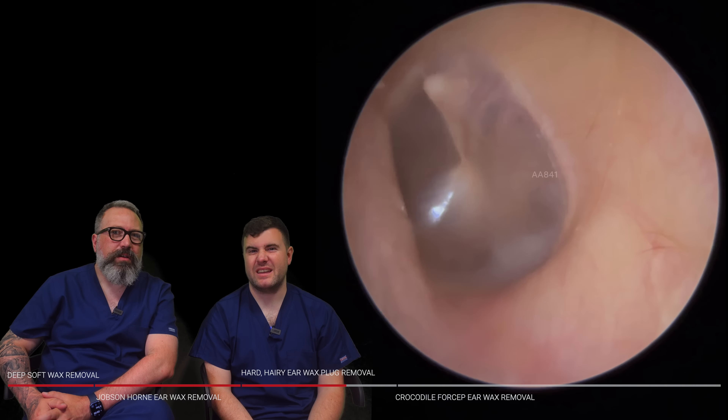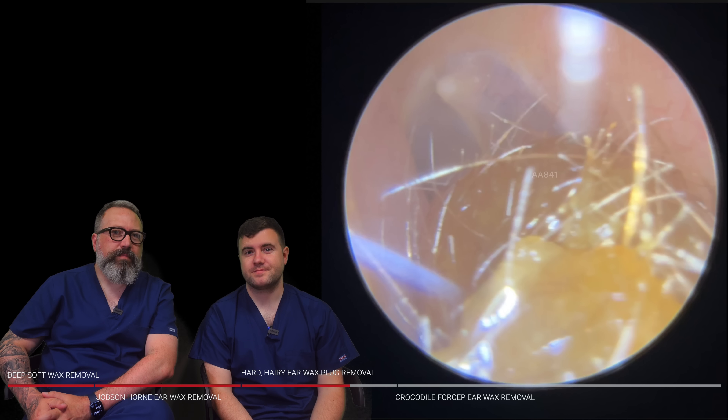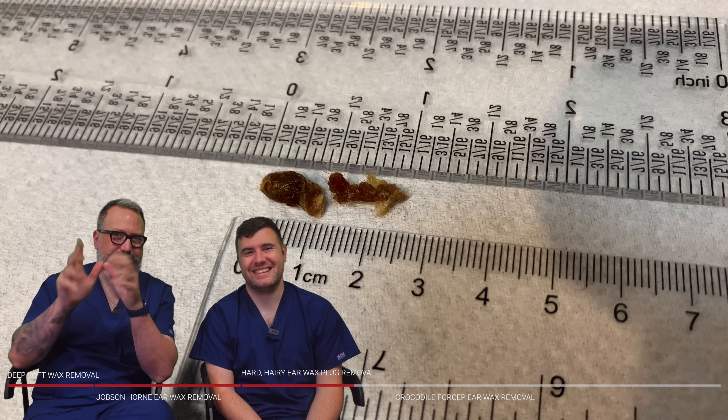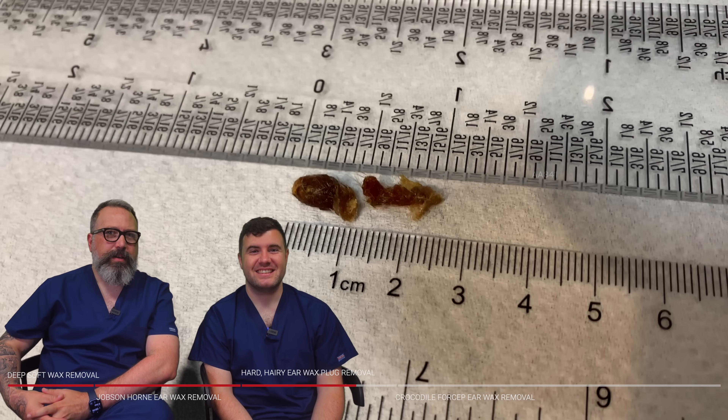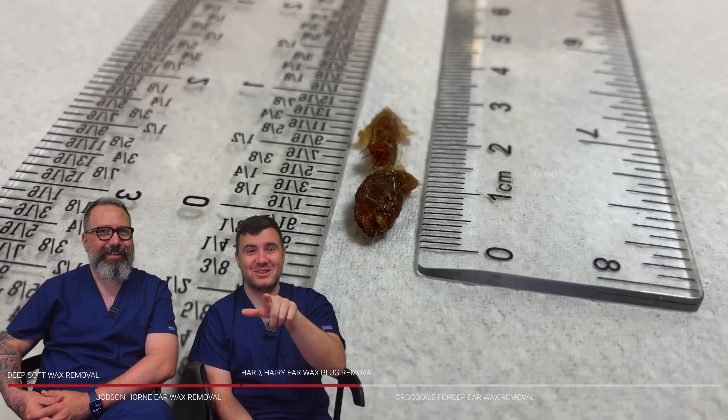I think you're quite lucky there that the ear canal is not narrow, because they're a bit of a pain when you have to hold the ear open and try and shimmy away. I think if it was narrow, I'd probably opt to use a bit of irrigation rather than suction. That would bring it away really nicely. That's actually come away quite nicely. It was really deep in there.